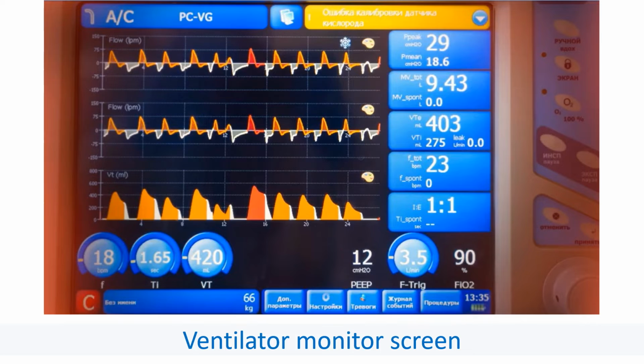Ventilator senses the breathing needs of the individual and gives appropriate pressures to inflate the lungs to either replace the breathing efforts of the individual or supplement spontaneous breathing in various disease conditions. The tidal volume delivered and the maximum pressure at which it can be delivered can be adjusted in the ventilator settings. Using too much of positive pressure can cause barotrauma to the alveoli. Various alarm settings can also be tailored to individual needs.